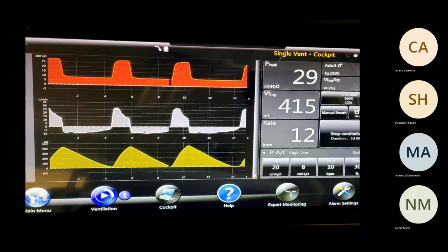No, not like this. It would be muscle expiration. It should be like this, is that right? But the patient still has activity. The patient is still trying to get more volume or more pressure, is that right? But with the rate, he does not have that much desynchrony. We changed this without giving him more sedation, is that right?